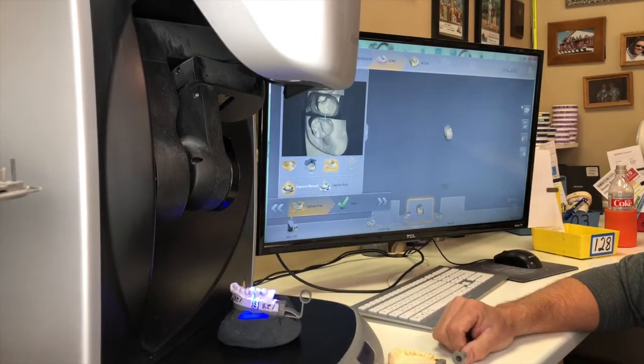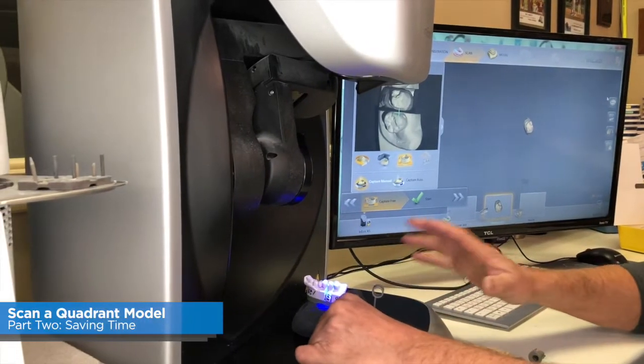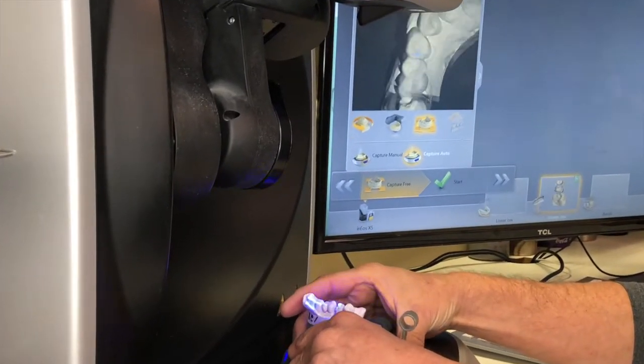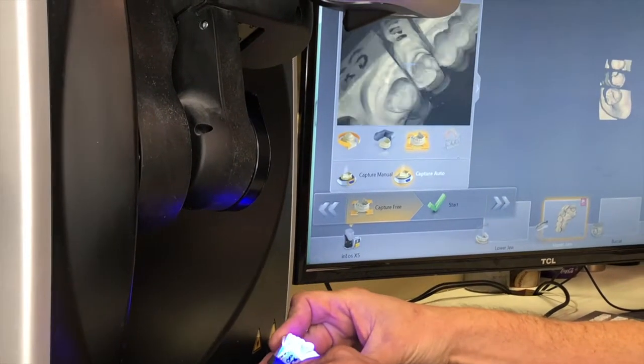Bill Atkison at Bellavita Dental Designs. This is your Tech in Two Minutes, part two of your quadrant scanning. I have already chosen manual scanning, which has brought my robotic arm up and out of position so I can take these manual shots.